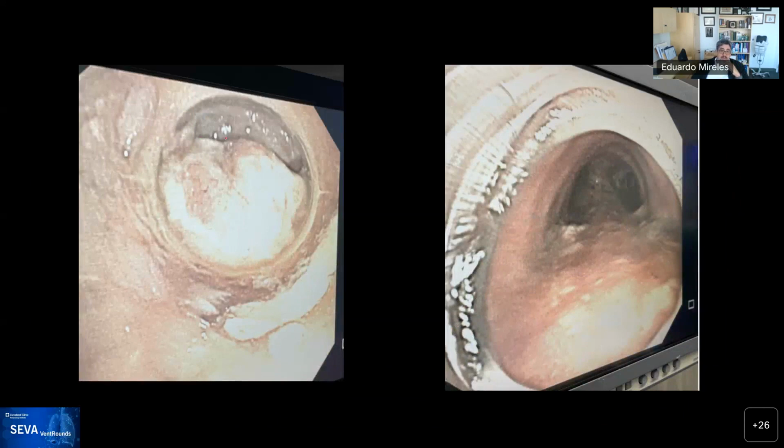So what I'm showing you here is the end of the tracheostomy that was replaced, and all of this granulation tissue, tumor, whatever you want. The air would go in, the valve would push back, and then when the patient wanted to exhale, they were exhaling through this lever that you have over here. So this is the area that the patient had to exhale. We changed the tracheostomy for a longer one, and the patient regained the airway.